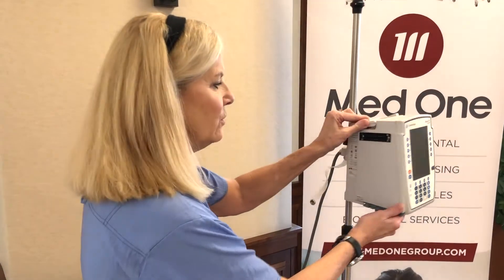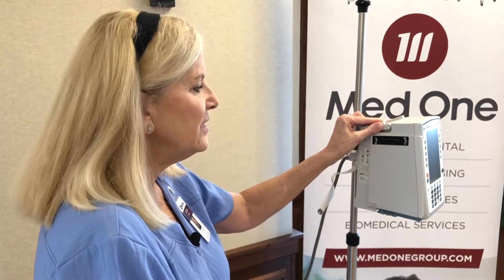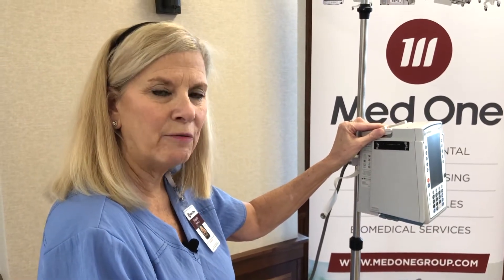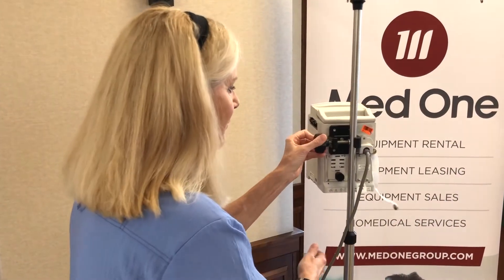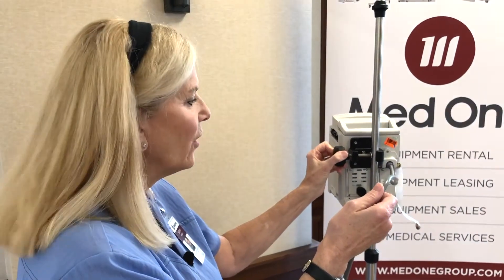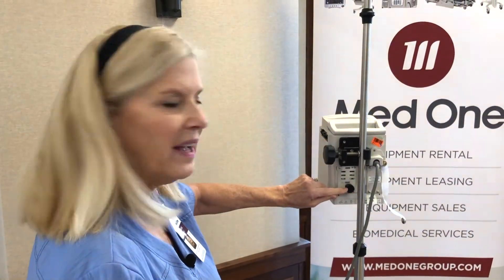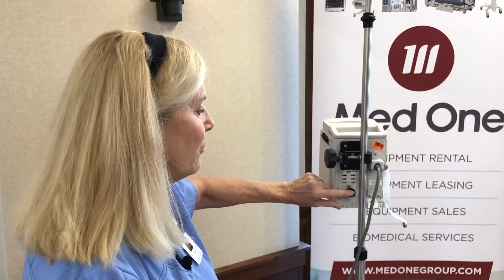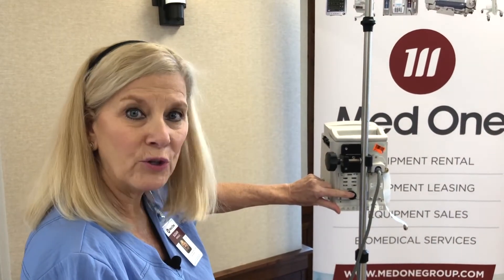On the sides of the PCU you'll notice what we call IUI connectors. These are where the modules for the Alaris system attach and reattach at a 45 degree angle. On the back of the device is where the power cord attaches, and this will power up to four different devices with just the one power cord. There's also what we call our tamper resist button — this black button you can press to lock out the panel so patients or family members cannot program the keypad when you're not in the room.